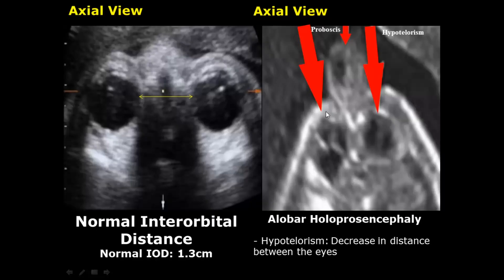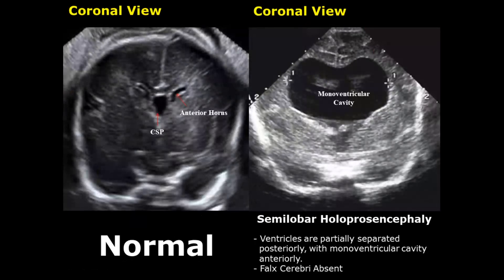Another facial abnormality is hypotelorism — the reduced distance between the orbits. Normally it is around 1.3 centimeters, but in hypotelorism it is lesser, and we can see the eyes much closer to each other. In semilobar holoprosencephaly, the ventricles posteriorly are partially separated, but anteriorly they are fused and form a single large monoventricular cavity, as shown in this image. The falx cerebri will also be absent.